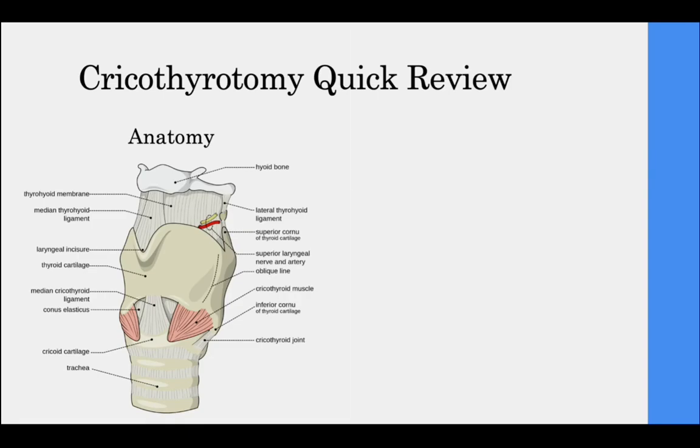So again, just reviewing that anatomy with the skin gone, from the hyoid bone to the thyroid notch, that's your 2 fingers in your 3-3-2. I think of that as my no-fly zone. From the hyoid bone to the thyroid notch is 2 fingers. I am not going to cut in that space. Then I'll find that smooth cartilage, walk down midline till I feel the first soft spot. Now remember, anywhere below the thyroid cartilage is free game for a surgical airway.